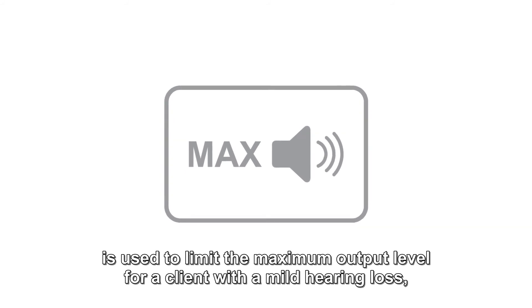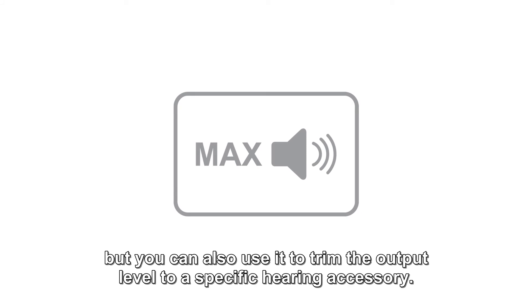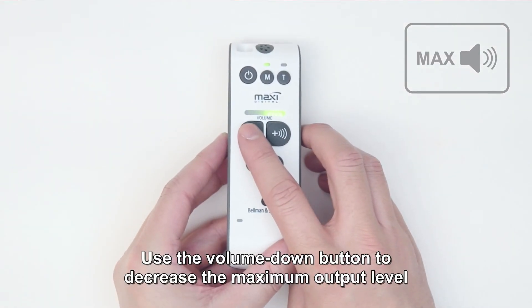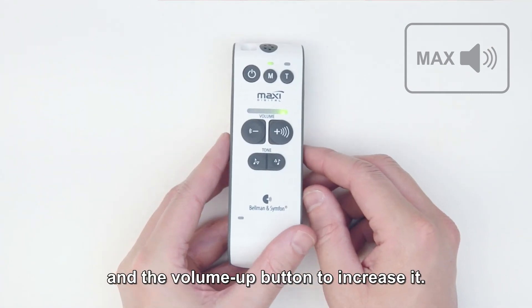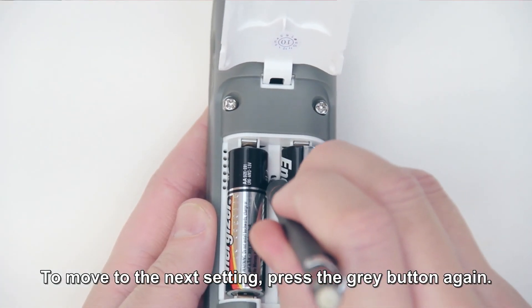Basic attenuation. This setting, called basic attenuation, is used to limit the maximum output level for a client with a mild hearing loss. But you can also use it to trim the output level to a specific hearing accessory. Use the volume down button to decrease the maximum output level, and the volume up button to increase it. To move to the next setting, press the grey button again.